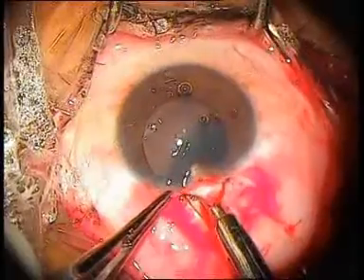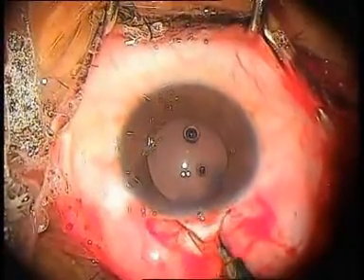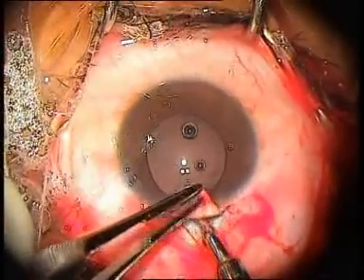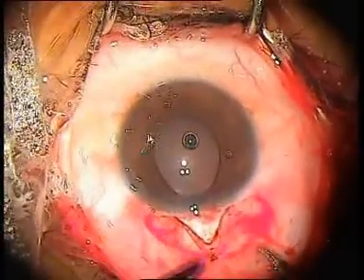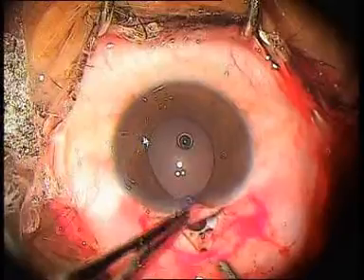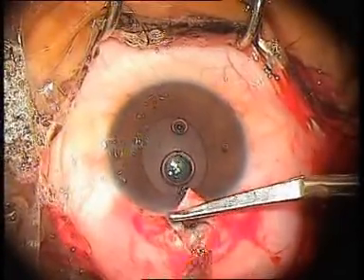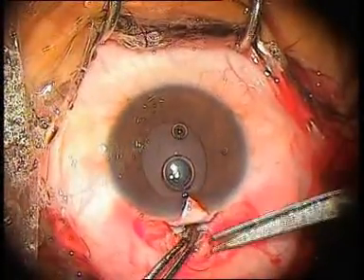The flap of the deep limbal tissue is excised using a scleral punch. The chamber is filled with viscoelastic and a peripheral iridectomy is done using scissors.